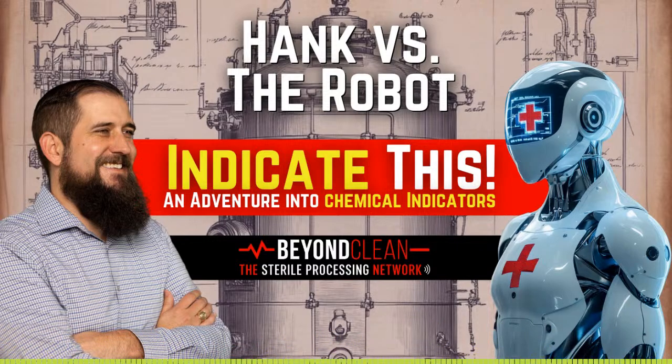Inside challenging areas, integrators, Class 5, should be placed in the hardest to reach spots, like the middle of dense instrument trays. These areas are known weak points where sterilization conditions can be the toughest to achieve. Avoid blocking pathways with densely packed instruments or improperly loaded trays. Indicators and integrators should be where air is most likely to get trapped. The manufacturer's instructions for use, IFU, will often include specific placement guidance based on their testing. For high assurance scenarios, e.g. implants, integrators can be housed in PCDs to simulate the most challenging sterilization conditions.